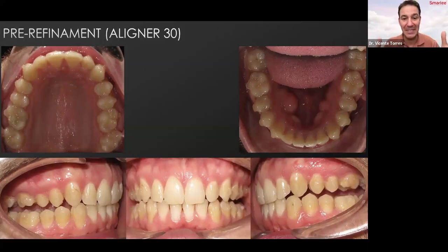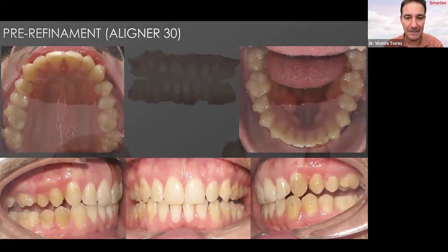So the patient finally, normally maybe at the aligner number in the middle of the treatment, when they remove the aligner, they feel they have no contact. So they prefer to eat with the aligner. So from the beginning it's a problem because it's very uncomfortable. At the end is a solution. So the patient feels more comfortable eating with the aligners with the blocks.